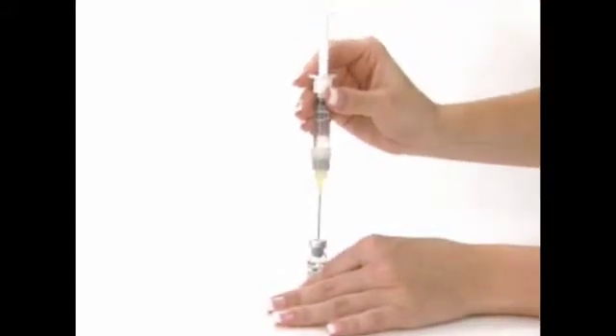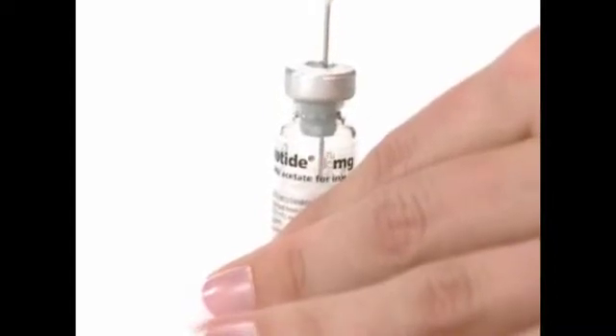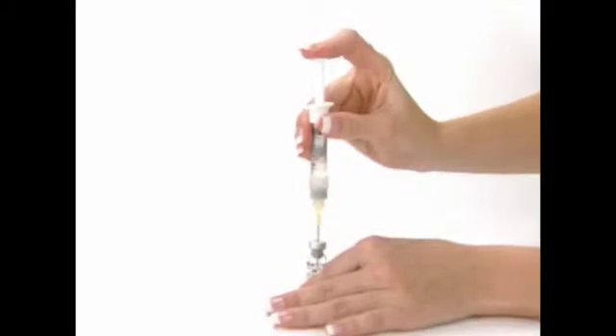With the vial on a flat surface, insert the needle of the pre-filled syringe straight down through the marked center circle of the rubber stopper of the vial. Slowly inject the water into the powder vial by pressing on the plunger.